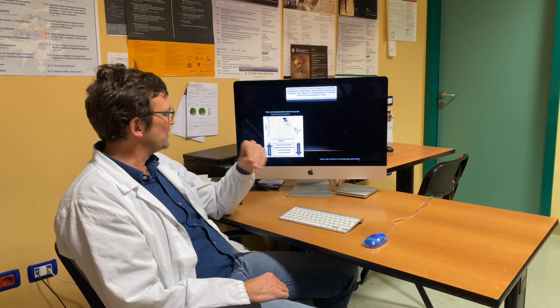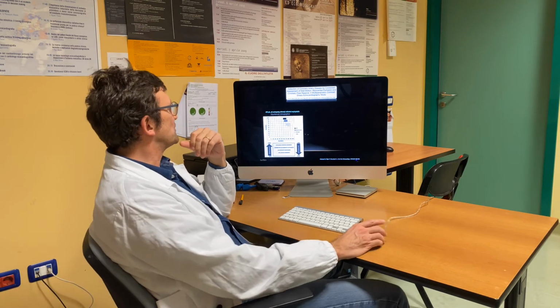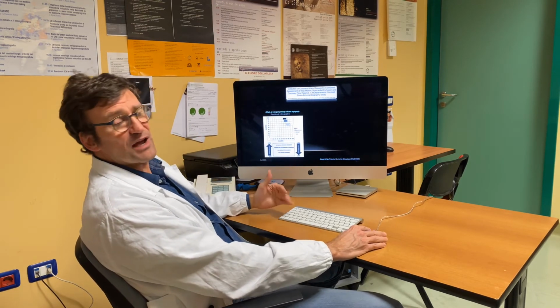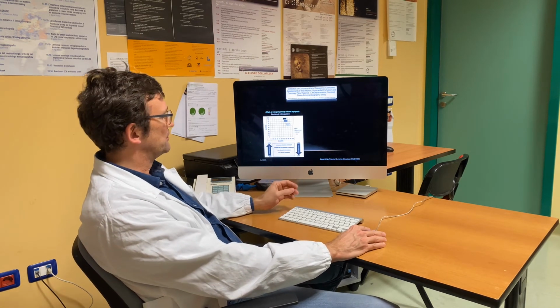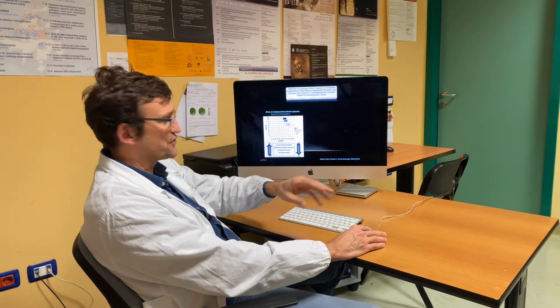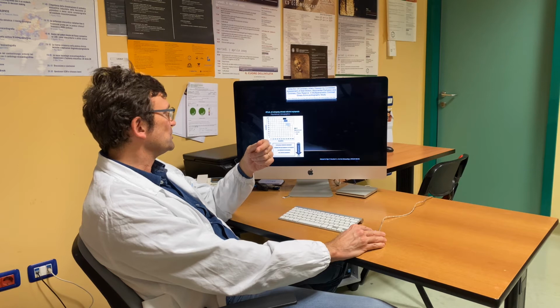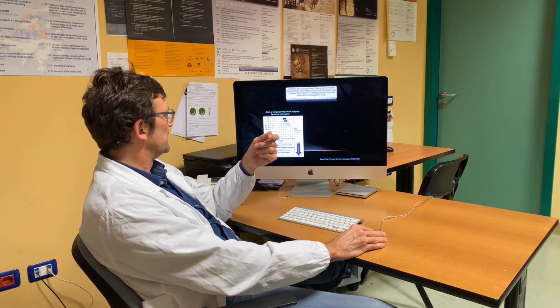We did a study 10 years ago, and we could study 400 patients with my friend Dr. Rigo. With this type of studies, you always have some referral bias, so this is the limitation, which probably is anyway scattered around the 3 modalities. So they probably cancel out when you compare the modalities. And so you have wall motion, which has a very high specificity. This is the blank one, the white thing here.